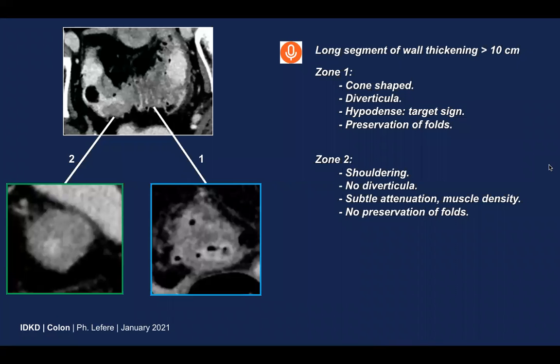To summarize: the long segment of wall thickening has two zones. Zone one: cone-shaped aspect, diverticula present, hypodense aspect, preservation of folds. Zone two: shouldering, no diverticula, subtle attenuation with muscle density, and no preservation of folds.